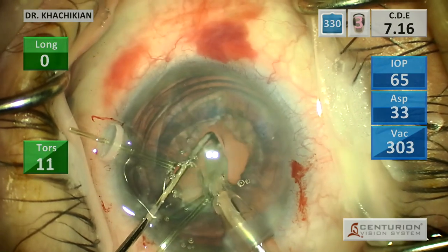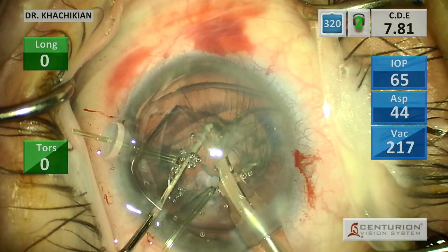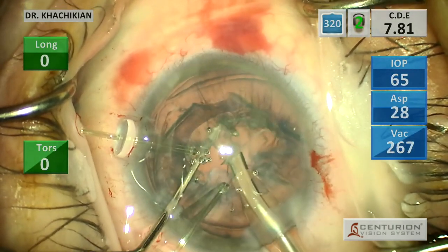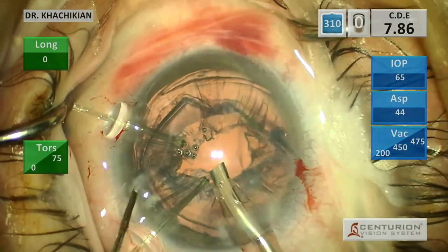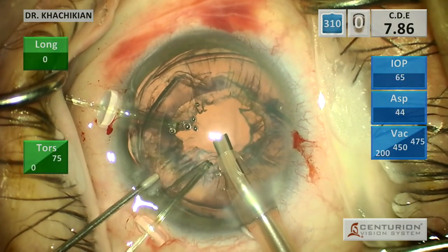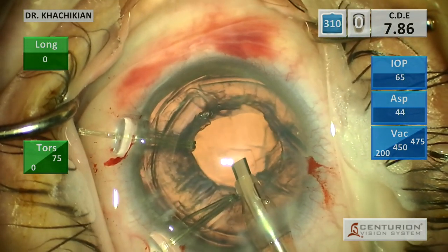Now we've got our nucleus out. We're going to go for our epinucleus. You can see we've gotten some cortical cleavage from our hydrodissection - there's cortex that wants to come out in addition to the epinucleus. So now we're going to be smart here: we're going to put more viscoelastic in. We don't want the capsule coming forward as we attempt to get out the epinucleus and the remainder of the cortex. Pretty soon we'll probably switch to IA.